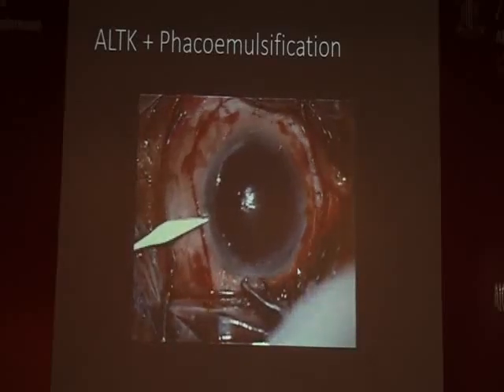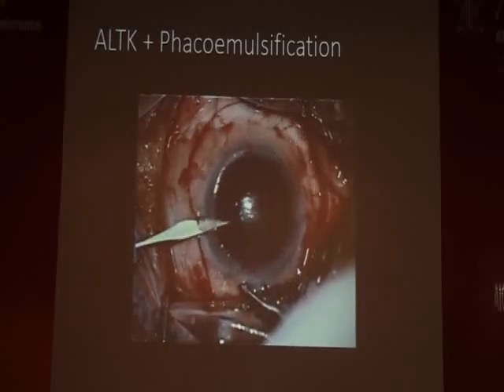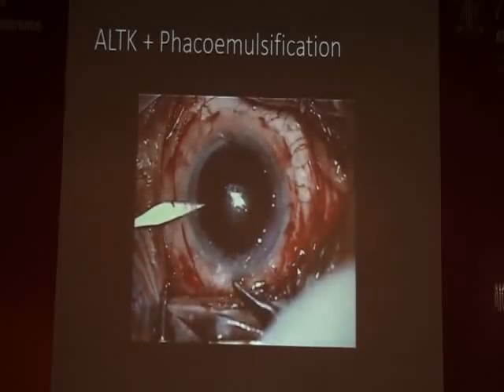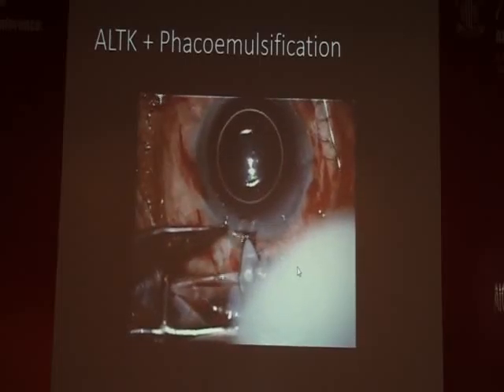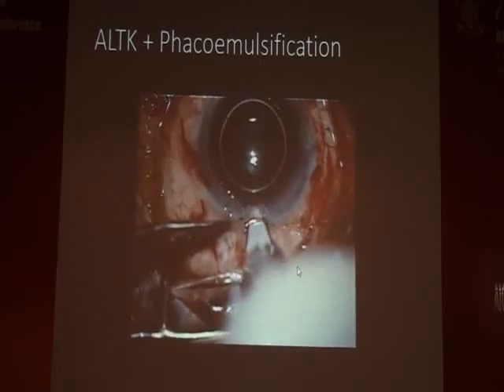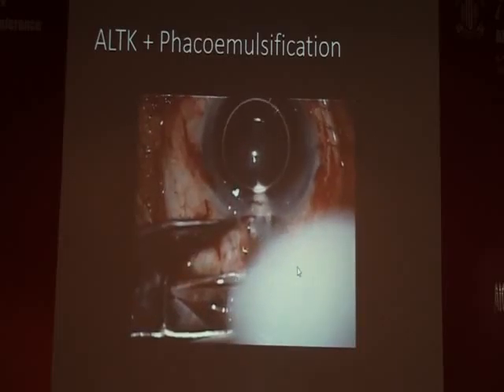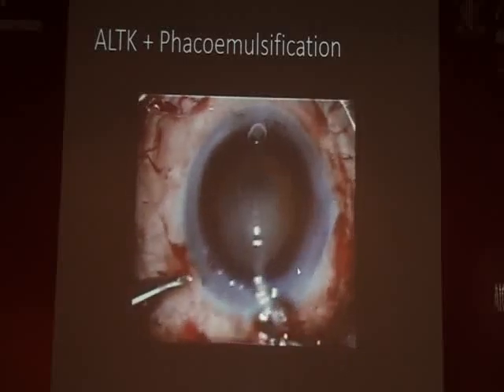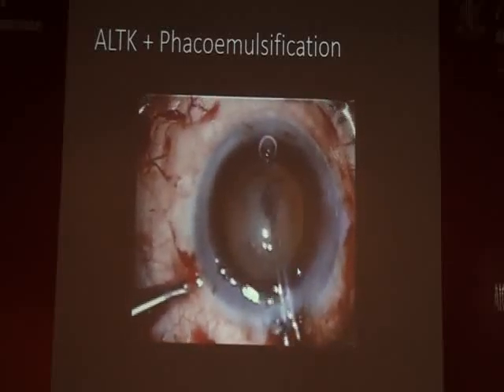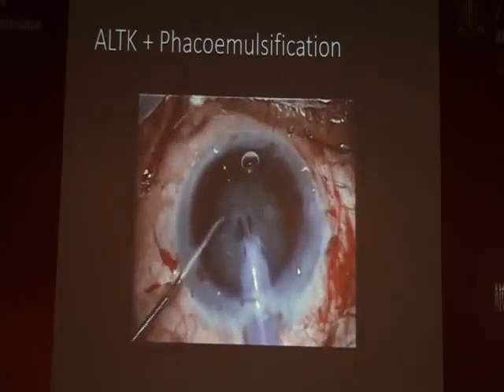Now, before placing this on the recipient bed, phacoemulsification is done just as one would do routinely. A little caution is required in making the ports, because now you have a little less tissue over your MVR blade as well as over your main port incision. And because some amount of corneal haze may still be present, it is always better to stain the anterior capsule with trypan blue dye.